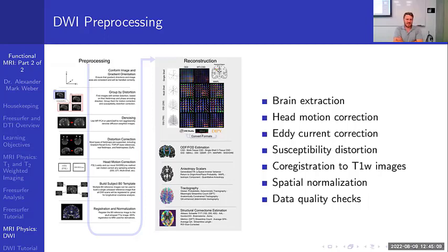Yeah, I don't know how sensitive DTI is to blood vessels themselves, but you can look at blood vessels using susceptibility weighted imaging to get a quantitative susceptibility map. But you could also do arterial spin labeling, which will look at cerebral blood flow more specifically, which I think is what you're getting at. And I was mentioning before that some people recommend functional arterial spin labeling over BOLD imaging. Yeah, there's a lot.